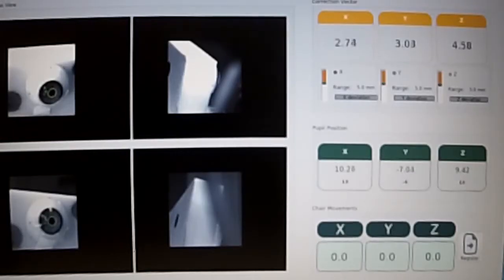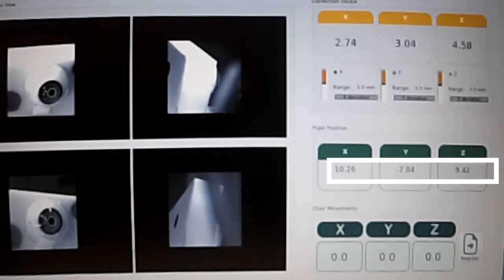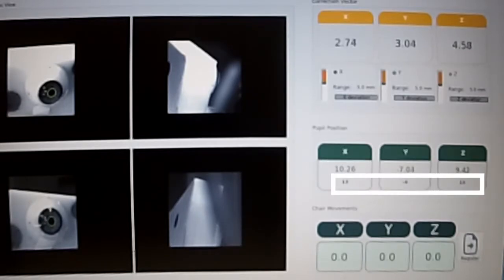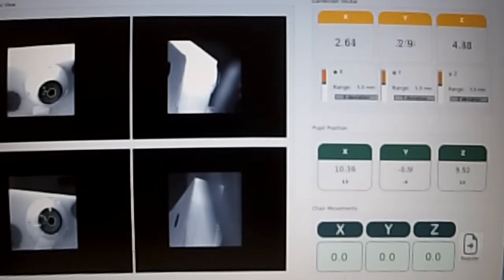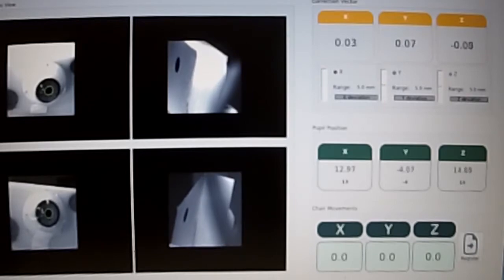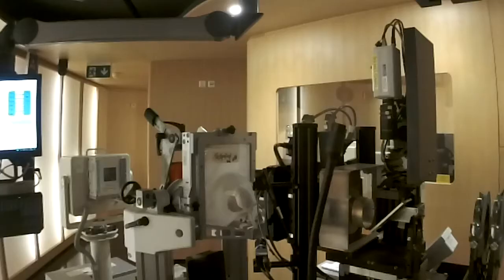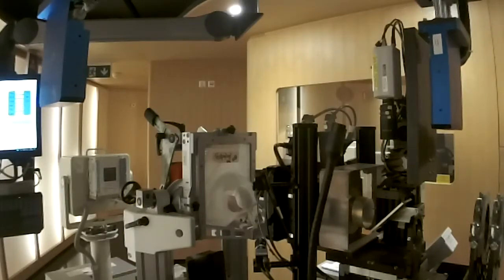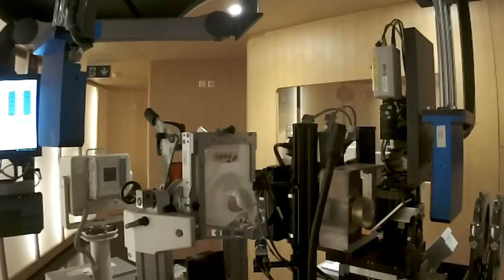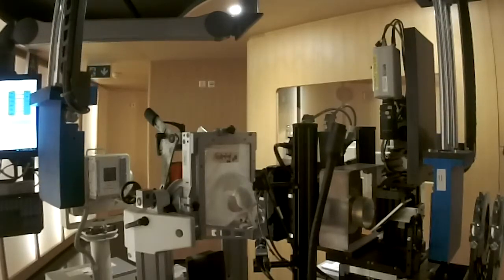As a result, by comparing the real-time measurement of pupil position with this reference, the ETS provides on a patient-specific basis an estimate of the correction in form of chair translations required to align the eye to the planned treatment position. After this pre-alignment, X-ray imaging of clips was performed to fine-tune these corrections. We compare the tumor beam alignment accuracy achieved with these 2 methods.